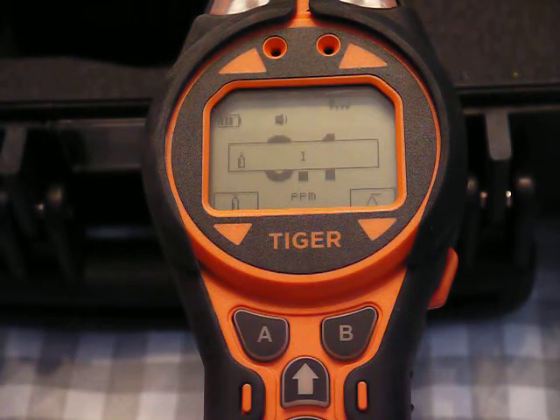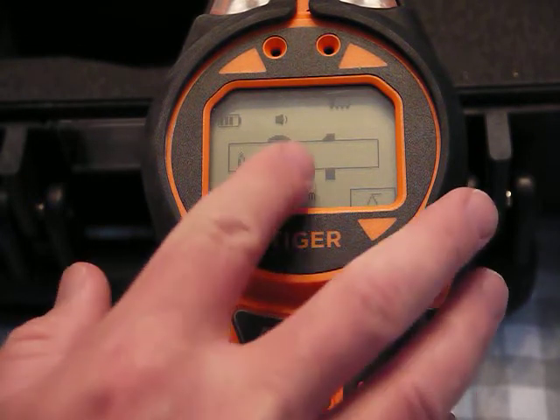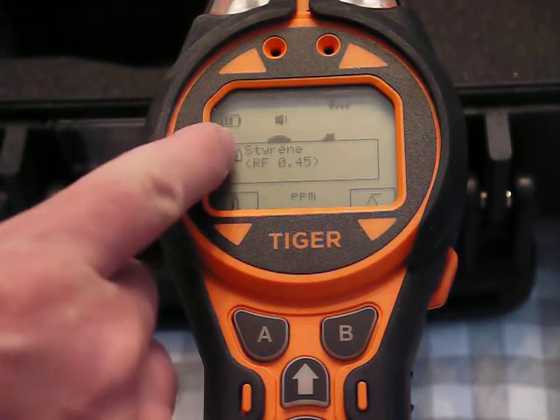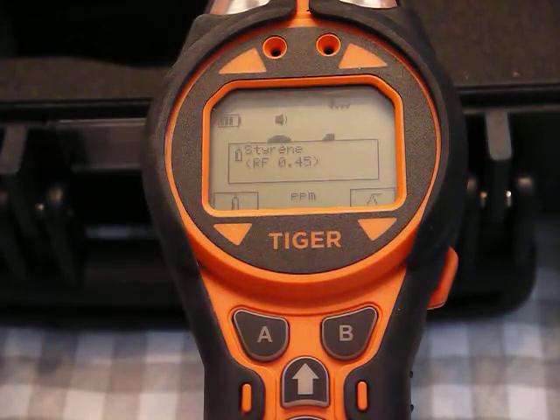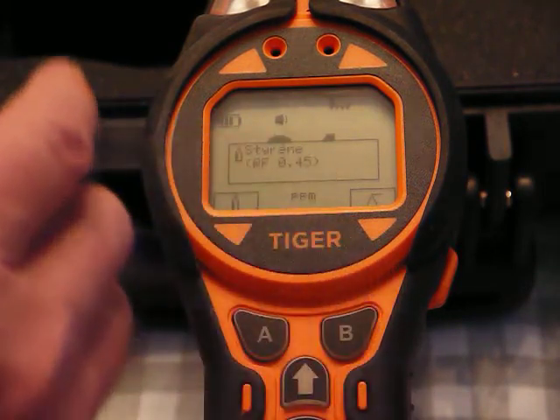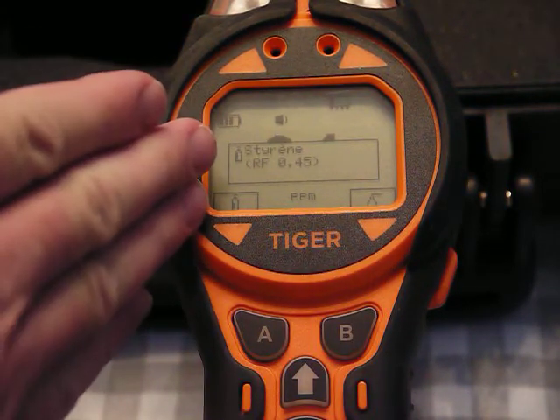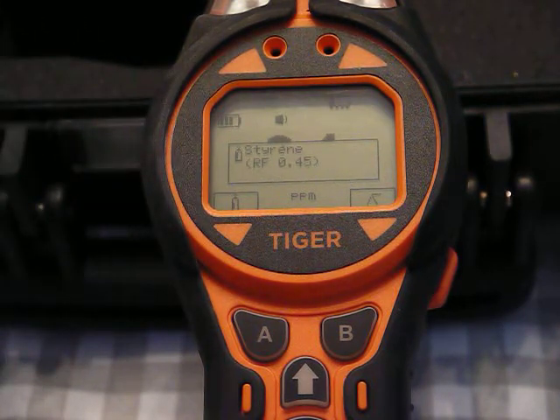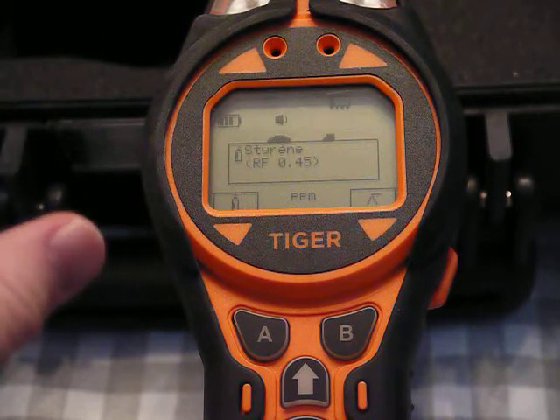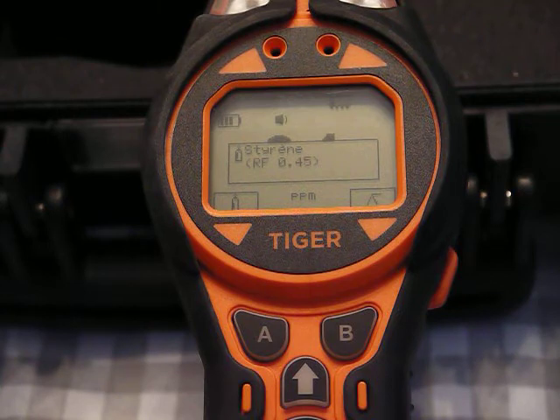Say I'm going into an area where there's styrene. I can go to S and scroll through — there are 300 to 400 chemical response factors built into the Tiger. Styrene's response factor is 0.45, so my reading gets multiplied by 0.45 and it measures in styrene PPM units.